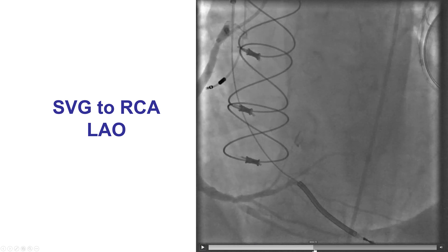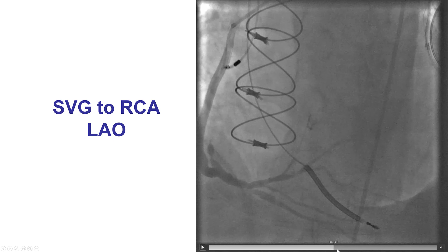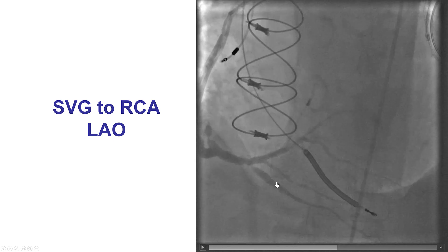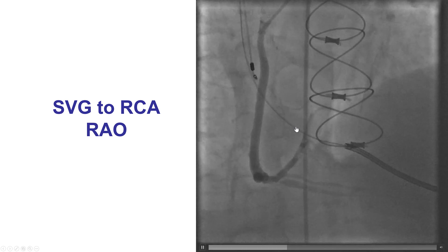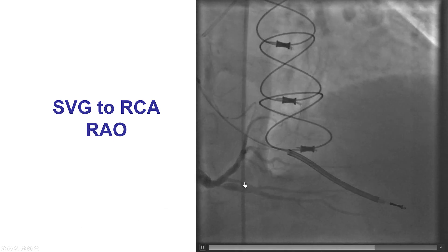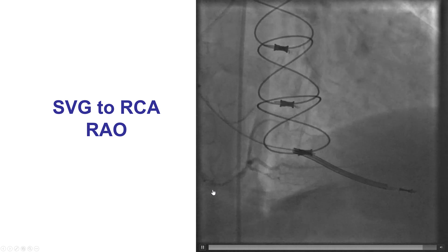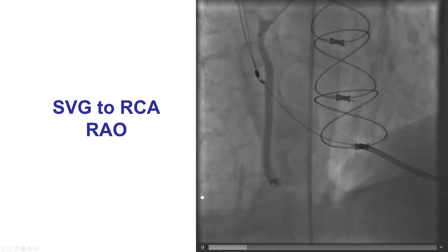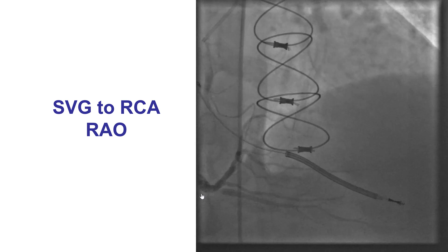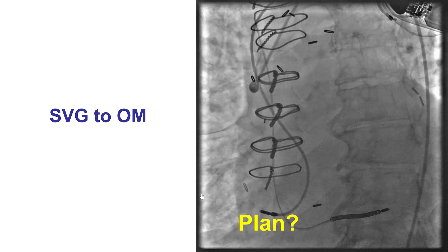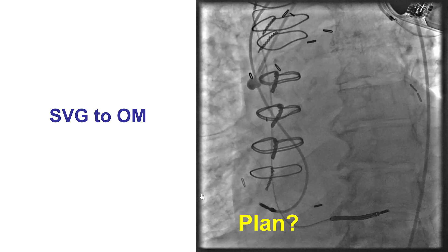However, there was a high-grade lesion at the origin of the right posterior descending artery. The right posterolateral was in good shape. This different view also shows the high-grade lesion in the origin of the right posterior descending artery. There was also another occluded graft to the left.